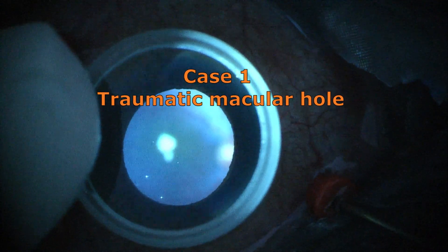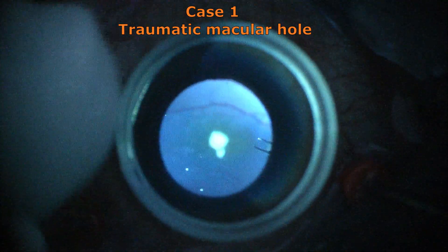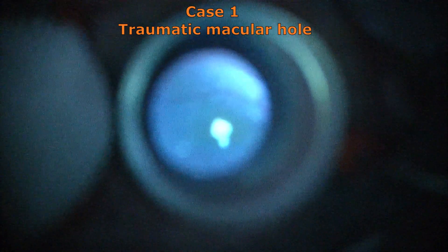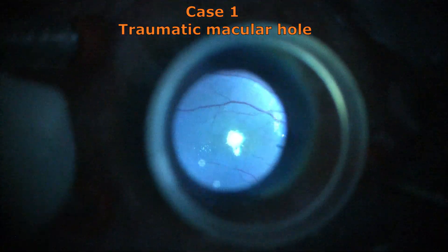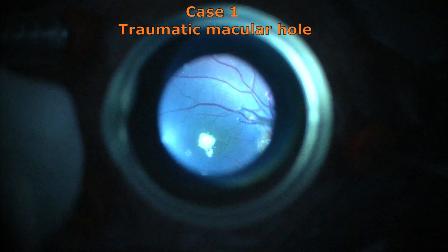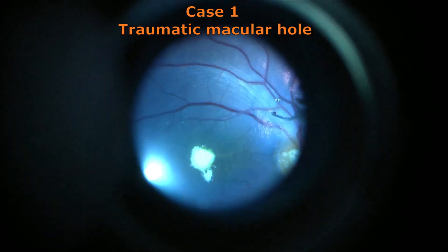It is always better to use Lander's lens, which provides an upright, same-size image with no minification or magnification, because this is the flat lens from the Lander's lens set and it has the advantage of giving you a very crisp and very clear view with no artifacts.